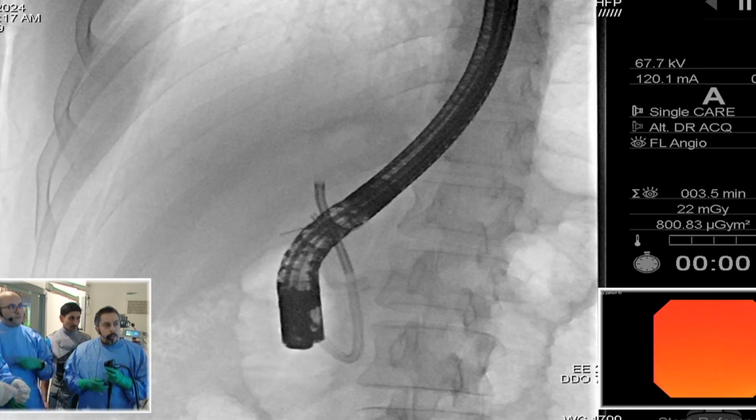I think we all believe that probably a stent post-cholangioscopy is much better, because when you fragment after laser lithotripsy or EHL, there might be a transient biliary obstruction, edema, swelling, fragments. You really don't want the patient coming in the middle of the night with cholangitis post-cholangioscopy. So I like to keep the stent in place to maintain biliary drainage and decompression and prevent transient biliary obstruction.